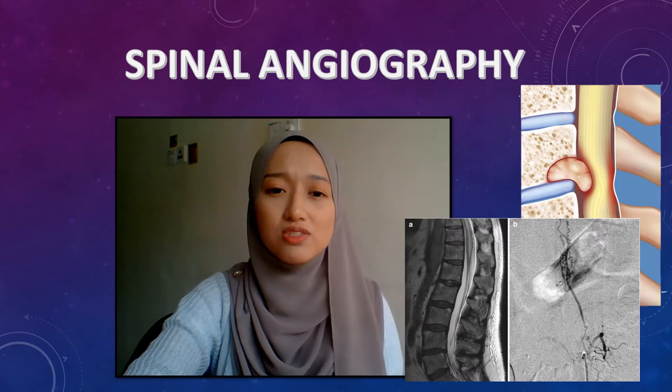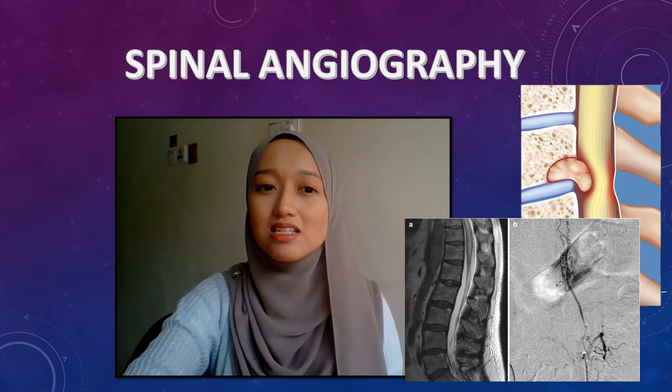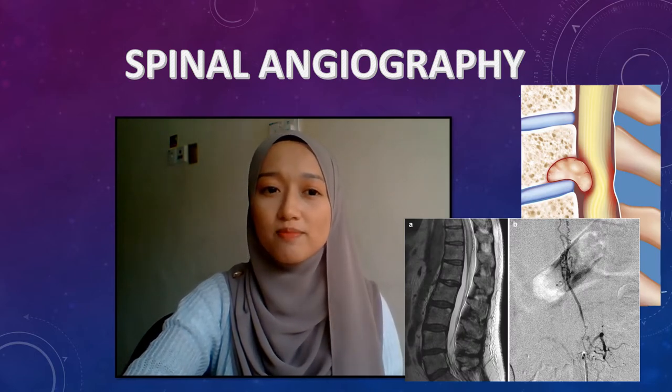And how about spinal angiography? Spinal angiography can be diagnostic and interventional. It can be used to understand the current state of your spinal tumor and provide minimally invasive treatment to facilitate safe removal of the tumor.